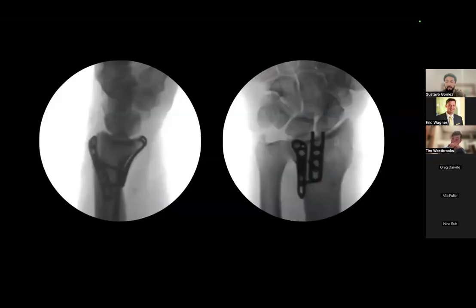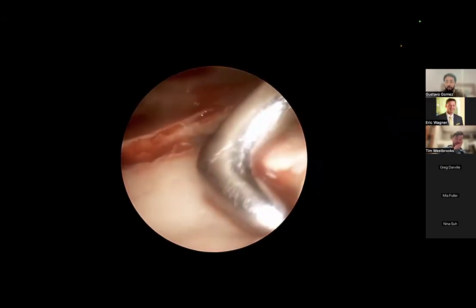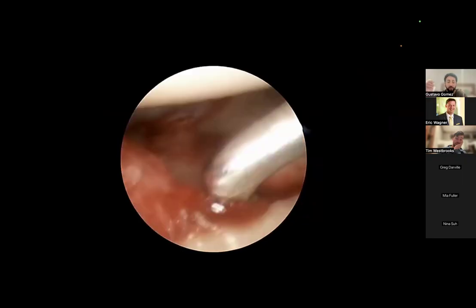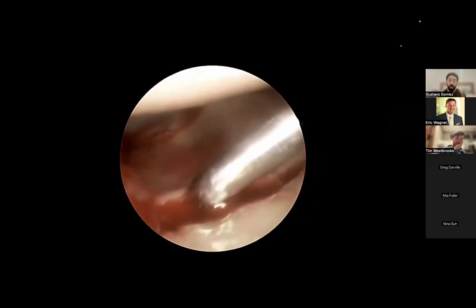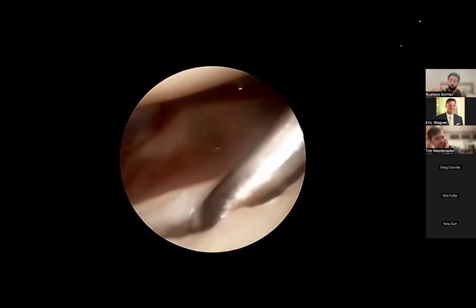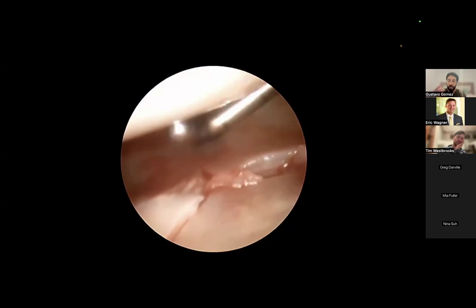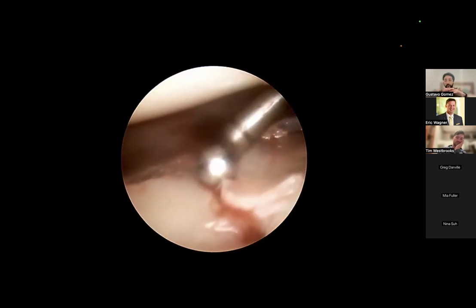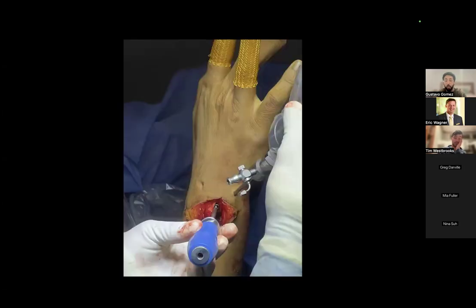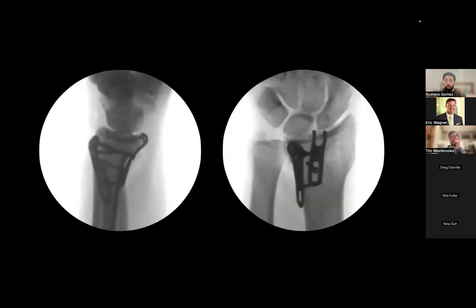And you can see that we just fix the proximal screw, as I said before. We reduce the articular fragments at the articular surface. You can see this central depressive fragment. So we introduce a probe in the fracture line and we try to rotate this fragment in order to elevate this fragment and put it at the same level as the rest of the articular surface. And after that, we fix distal screws with this intraoperative result.